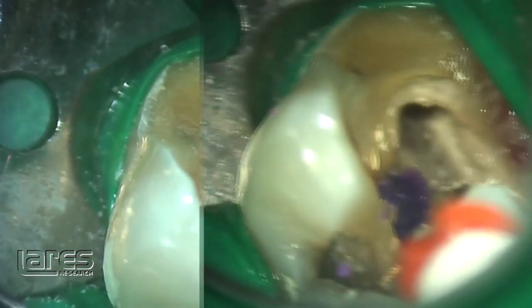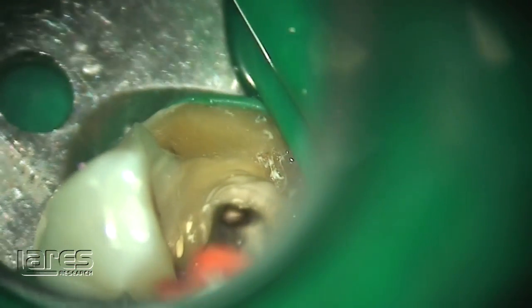Three-dimensional streaming and cleaning of the root canal system with PIPS — streaming and cleaning. We were extremely excited when we saw this because we thought, oh my gosh, if we can just get the PIPS effect to be placed in any one of these canals, the effect could be seen in all the canals.